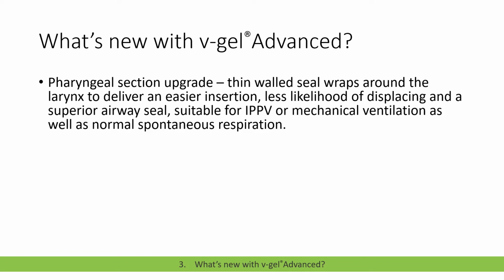This airway seal, in my experience, will seal at airway pressures between 15 and 25 centimetres of water, and that makes it suitable for IPPV, so that might be squeezing the rebreathing bag, or mechanical ventilation, as you might see in referral practice or more advanced anaesthesia, but as well as normal spontaneous respiration, where your patient is just breathing for themselves, as you would see in general practice.